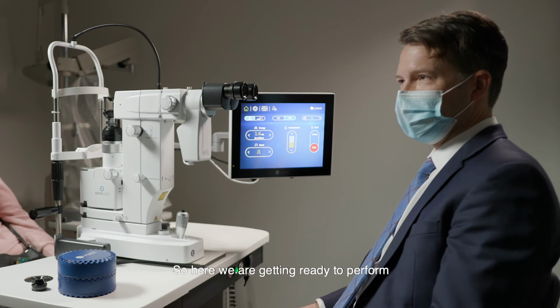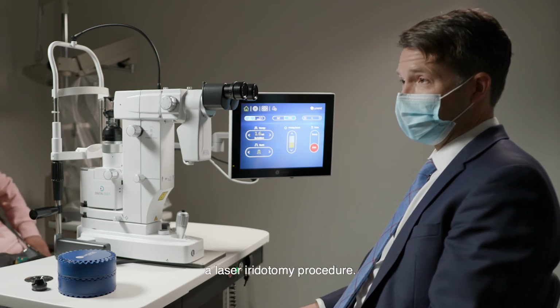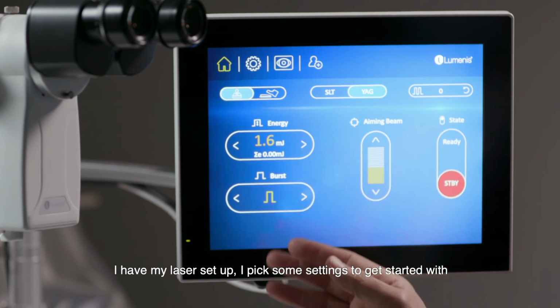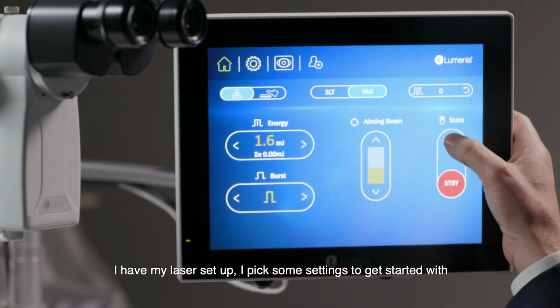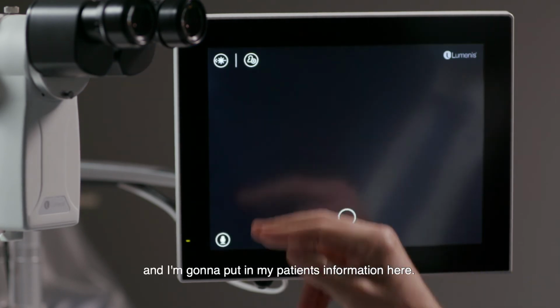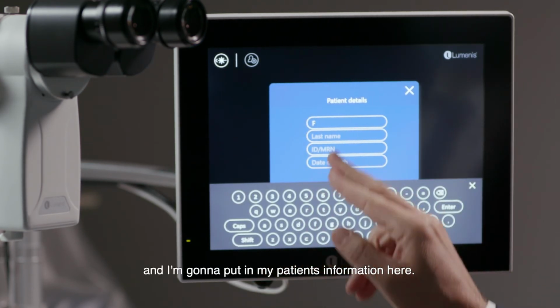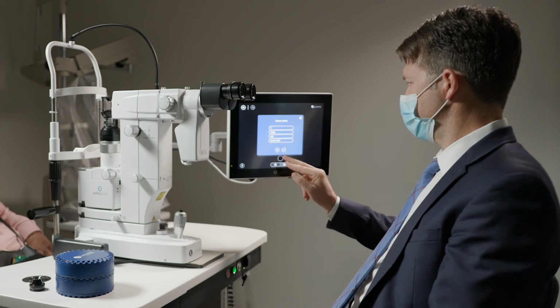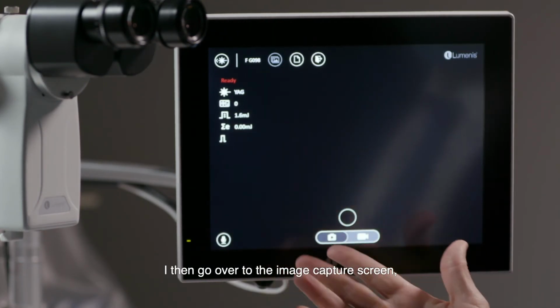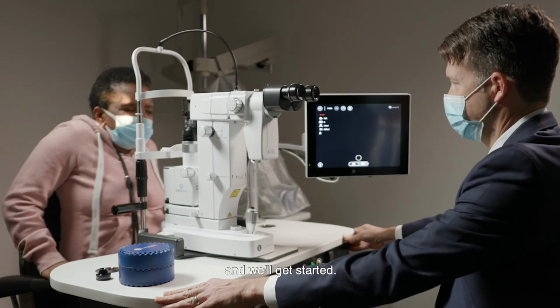So here we are getting ready to perform a laser iridotomy procedure. And so I have my laser set up. I picked some settings to get started with. I'm going to go ahead and activate the laser, and I'm going to put in my patient's information here. And we're ready to go. I'll then go over to the image capture screen and we'll get started.